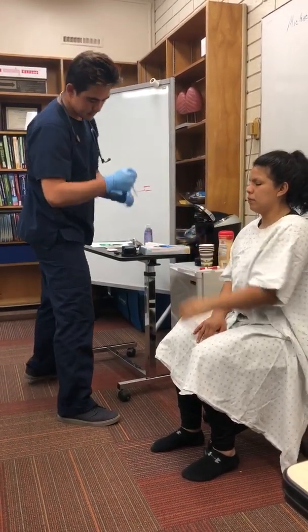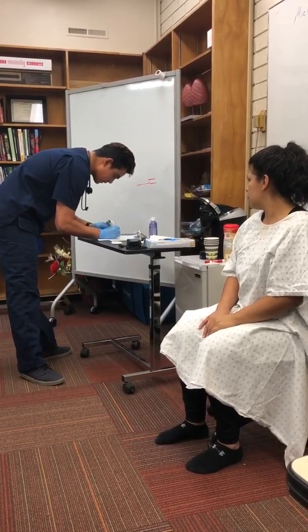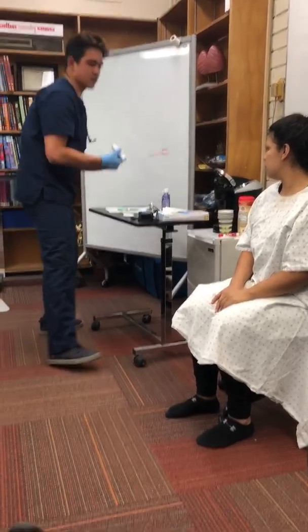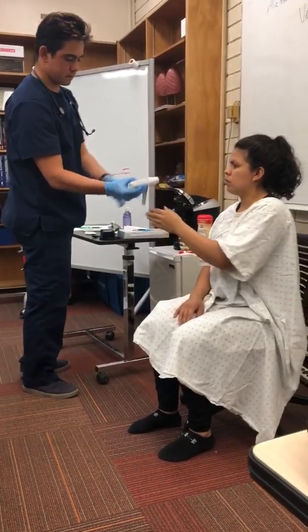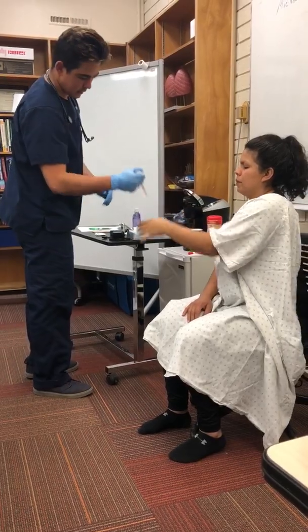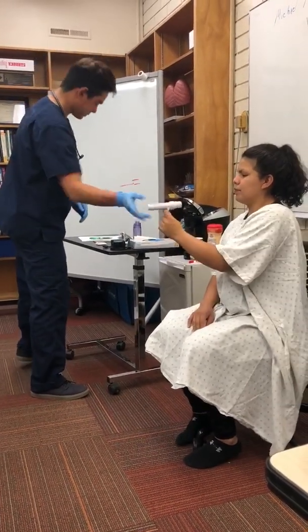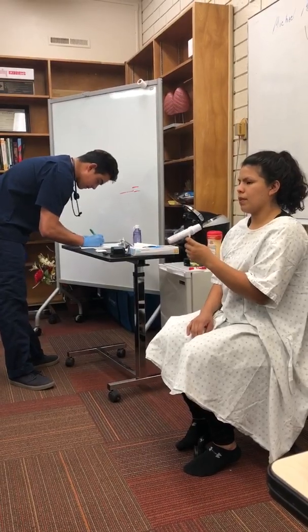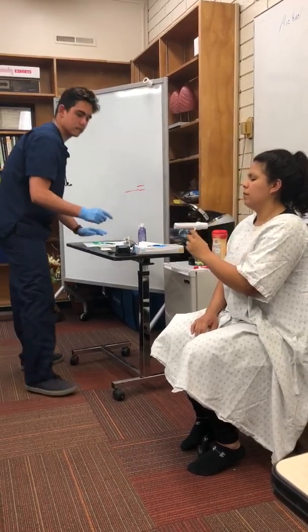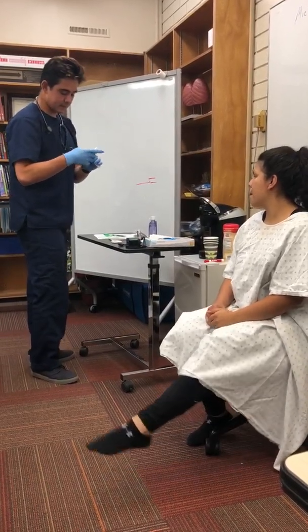Okay. 210. Noting patient effort as well, so good effort right now. Thank you. 190. And 210 again.